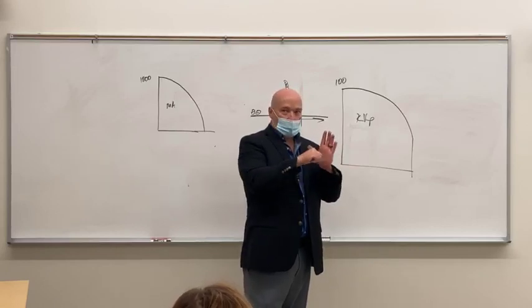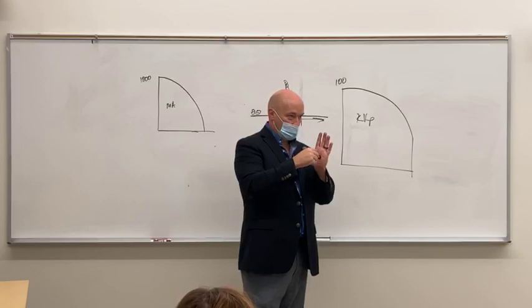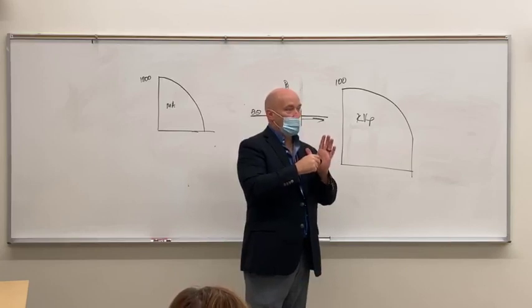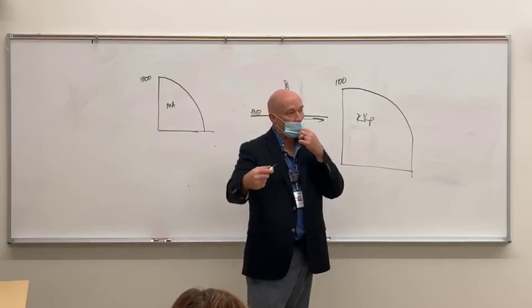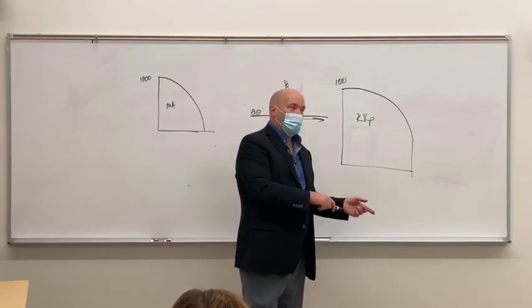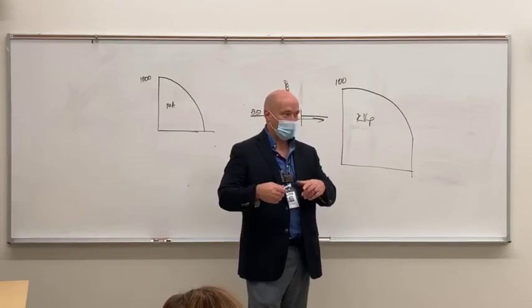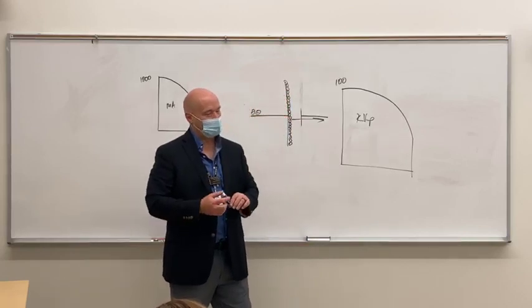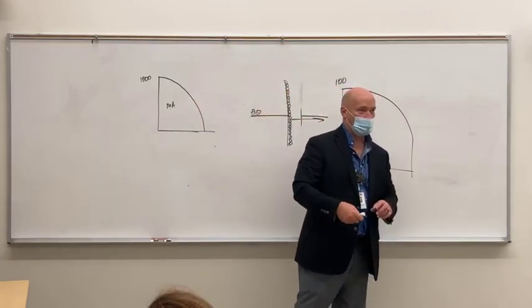But if it's wired directly into the middle of the secondary side of the high voltage generator, then the voltage is at 0. Even though it's on the high voltage side, it works off the low voltage. So it's not in the low voltage circuit, but it does work off of low voltage. So again, I hate to give it away this blatantly, but I think it's a true false question.